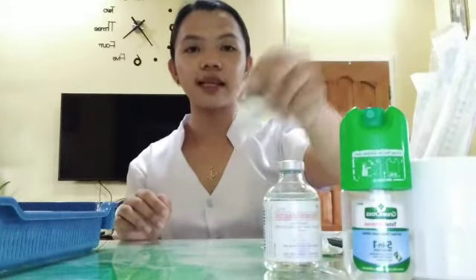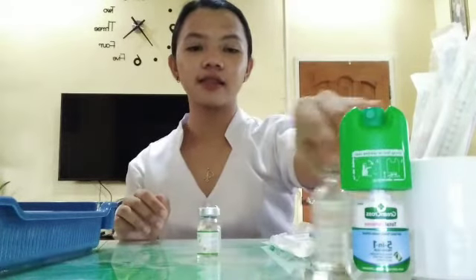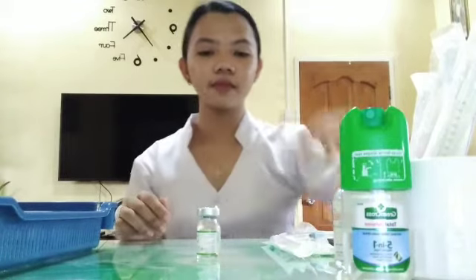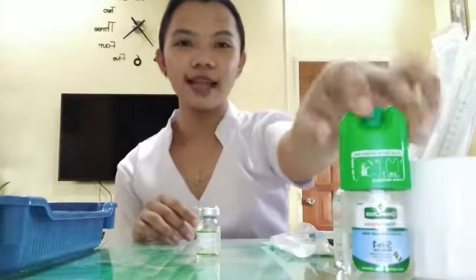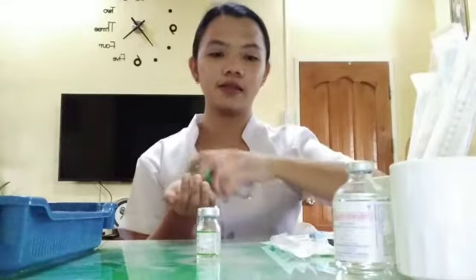So we will get the ampicillin, and then after getting it, we will wash our hands again, and we will prepare for withdrawing the prescribed dosage of the prescribed medicine according to the medication ticket.